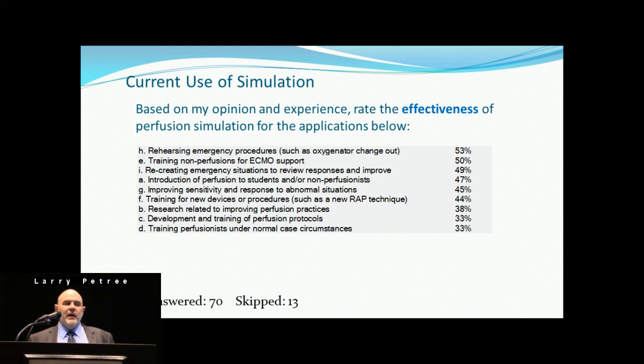So as we become a more litigious society, I think we've probably all been involved in one degree or another of an investigation around a clinical incident. Simulation can be used as an investigative tool, and it can also be used to test a new procedure or a protocol so that you know where the bugs are before you apply it to a patient.